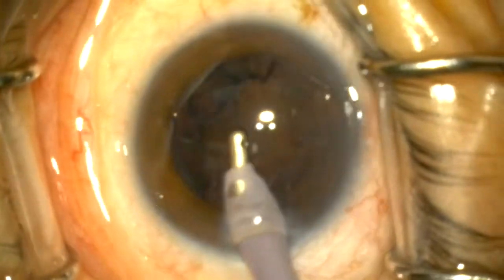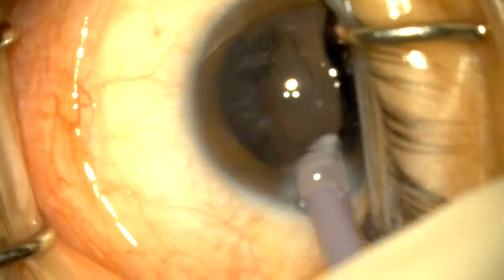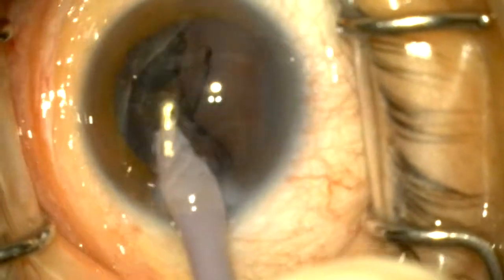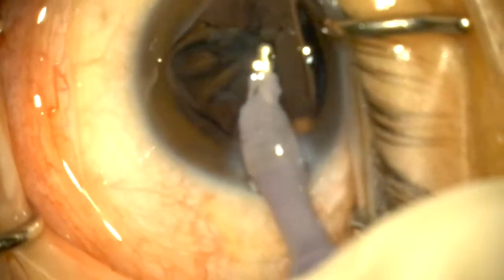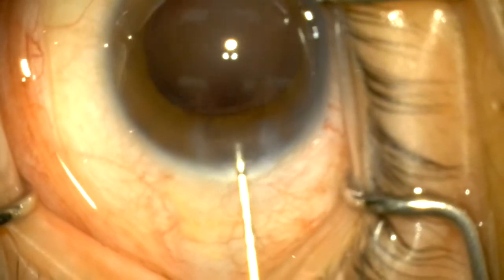I would remove the remaining cortical matter away by sweeping the IA probe in a large area to remove a large chunk of cortical matter, instead of taking tiny bits chunk by chunk. At this point, all the cortical matter were removed. I inject the viscoelastic to prepare for lens insertion. And this is where the nightmare begins.